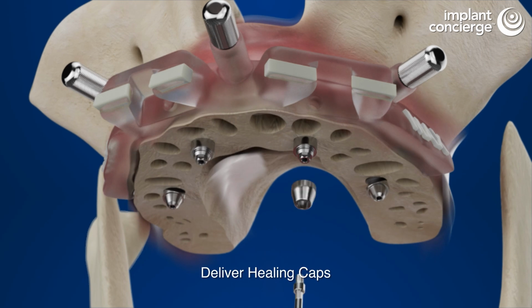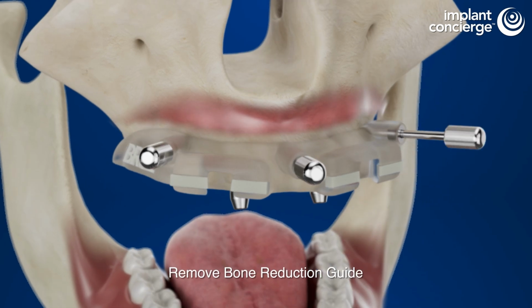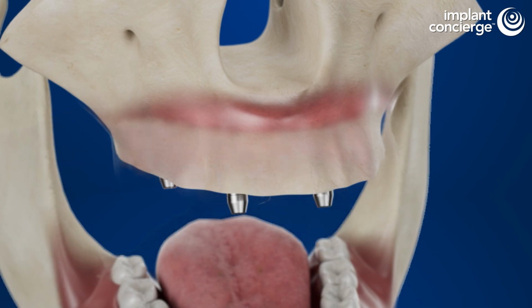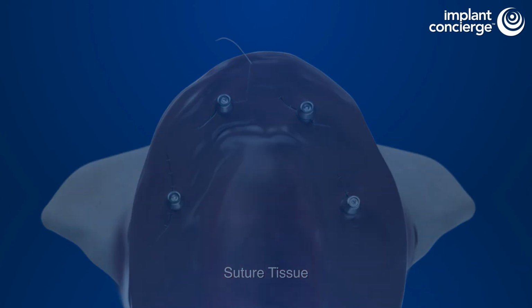Gently seat healing caps over the multi-unit abutments with hand pressure. Remove the anchor pins and then the bone reduction guide. Evaluate the surgical site and smooth any sharp edges if needed. Apply bone graft if necessary and suture the tissue around the healing caps.